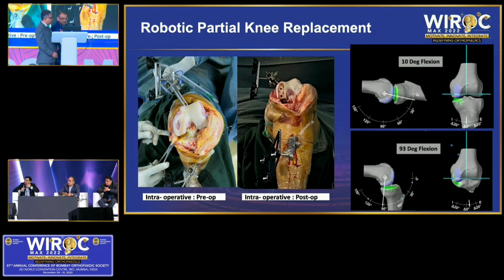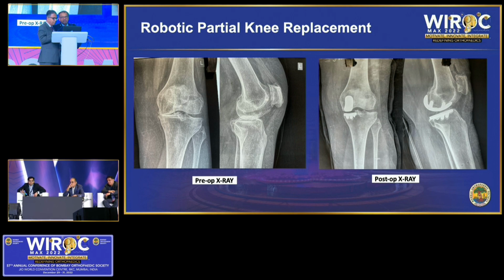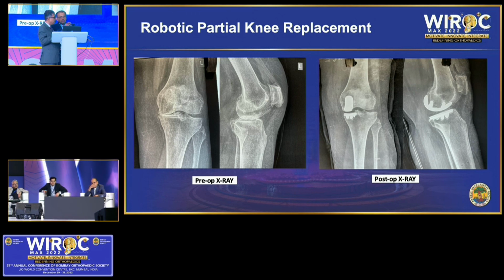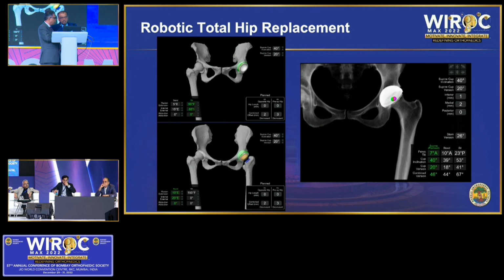I think what Tejas mentioned was very correct, that getting a tibial cut with robotic is that much more easier and safer. You don't undermine the ACL attachment at all, and you are able to get the gap status and even the contact status between the femur and the tibia, how their contact is going to be, and that will be definitely a game changer. With a good J-curve implant, they almost look like a normal knee. The only thing is that the indicated patients, as Mahesh or Chandrashekar mentioned, in the cases are very few.